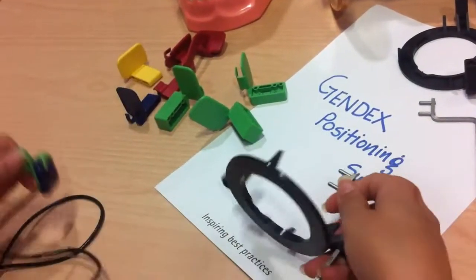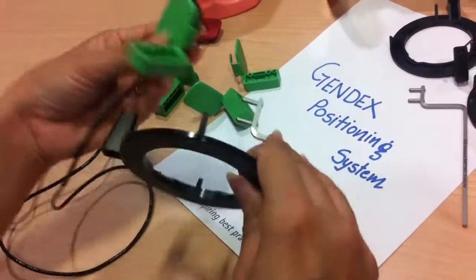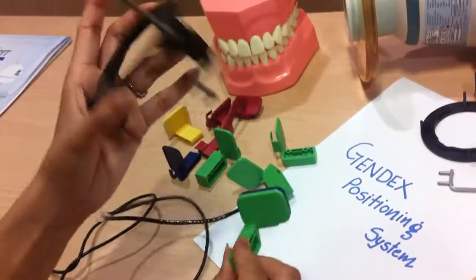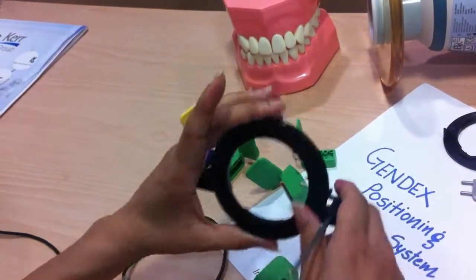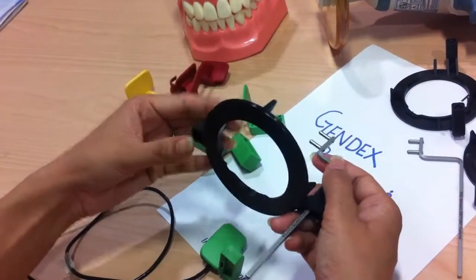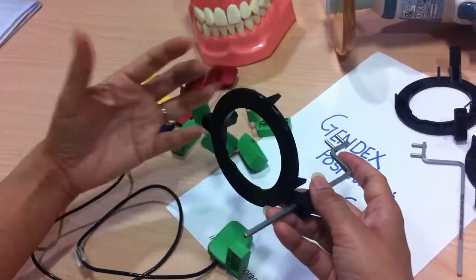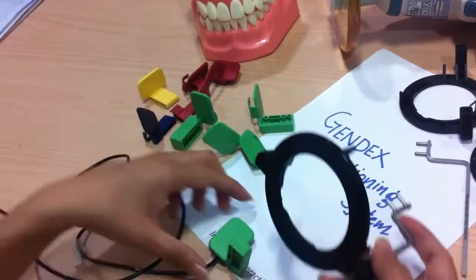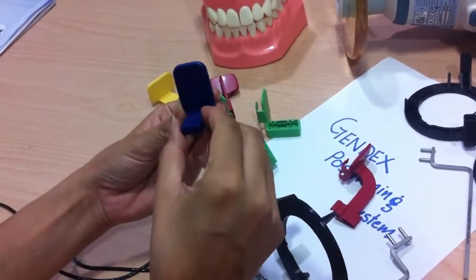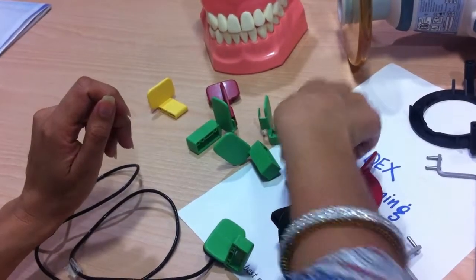Achieving accurate results depends on several key factors. Number one is the alignment of the sensor to the X-ray beam, which is ensured by the aiming ring — since the sensor is exactly in the center of the ring, we are sure we are exposing the complete area of the sensor. The second factor is ease of patient comfort. With these positioners, it is very comfortable to take X-rays, and the patient will also feel comfortable biting on the blocks or the flat surface, with the sensor easily accommodated in the oral cavity.